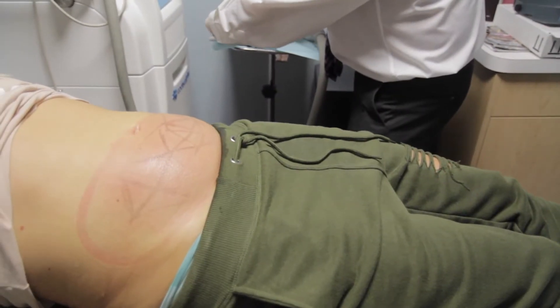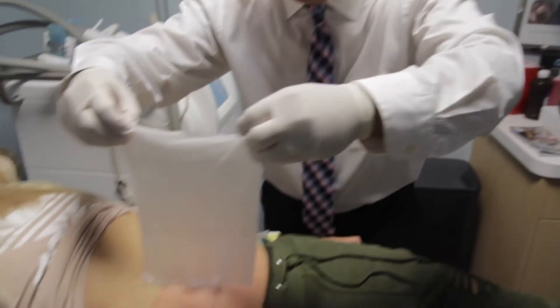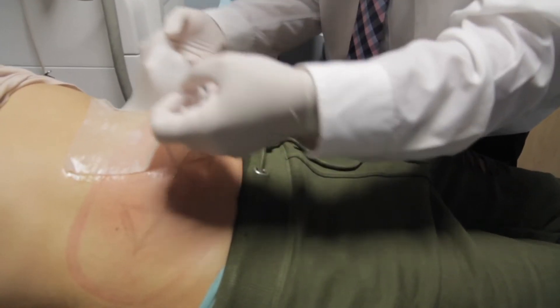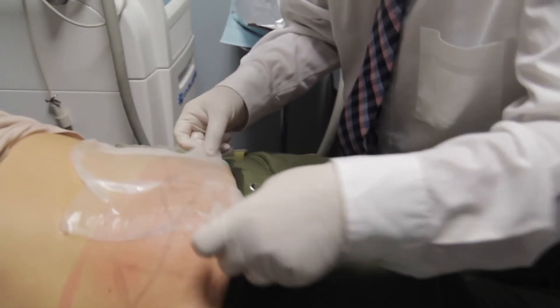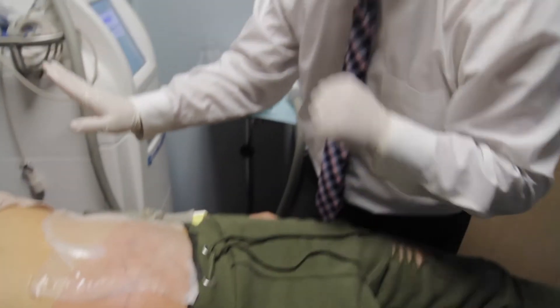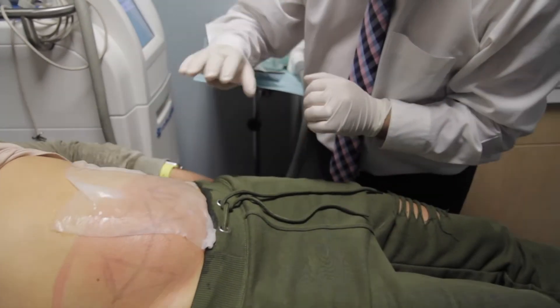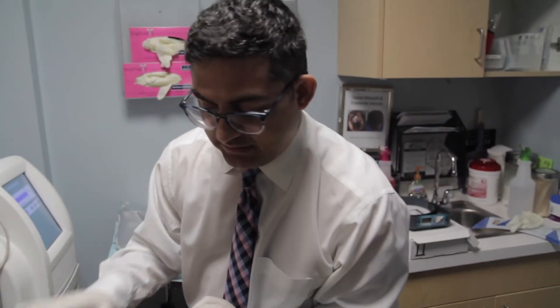I'm going to apply this cold gel onto the skin — sorry, it's going to be cold. This actually allows the suction to really grip well. We always have the bed slightly at an angle because that allows the machine to really suck the area effectively. Patients lying flat doesn't work as well — the angle is much better.